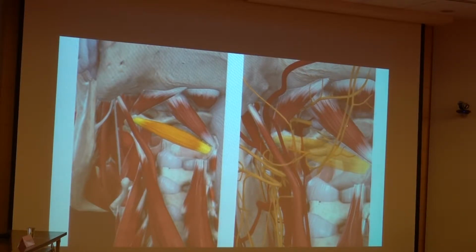And also the third occipital nerve, which is usually when you're trying to do intervention on the greater occipital nerve, in fact you are trying to do a lot of intervention on the third occipital nerve at the same time. Why? Because usually this nerve is traveling together with the ascending cervical artery, really trying to supply that C2-3 facet, and they're trying to surface underneath your obliquus capitis inferior and to meet the greater occipital nerve on top of the rectus capitis posterior major, which you are going to see very soon.